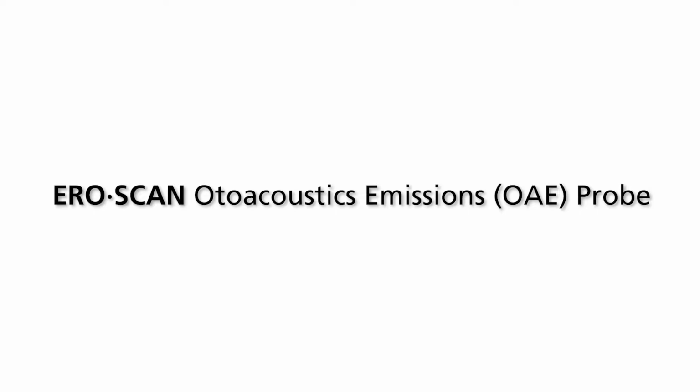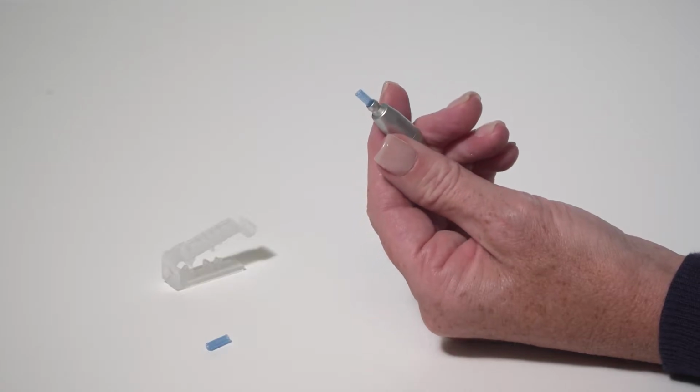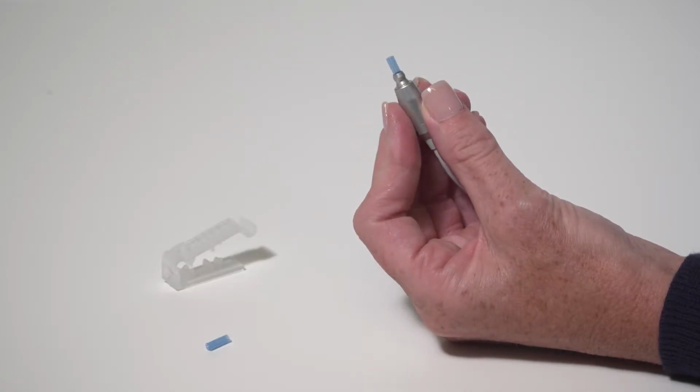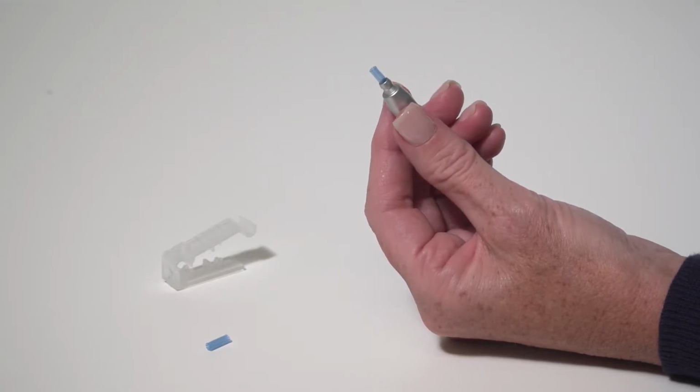This demo is to show you how to replace the probe tube of the ERO SCAN OAE device. Before starting a test, make a visual inspection of the probe tube to ensure it is clean and free of debris.